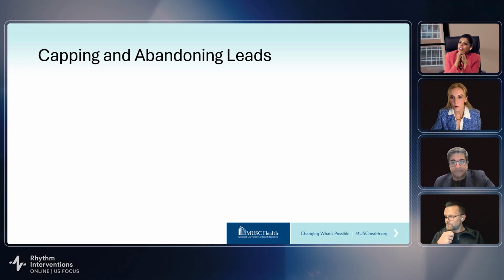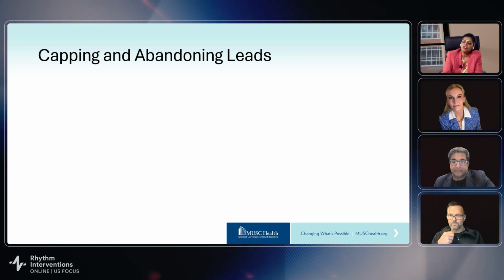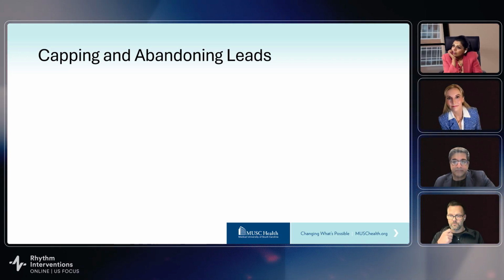Can I ask you a question? I just saw that you did a venogram. Is that routine for you before you pull it out? The CS venogram? Or did I miss it? Oh, that was going back in with the new LV lead.